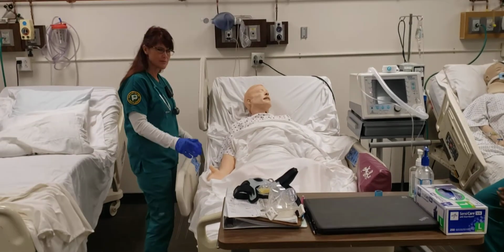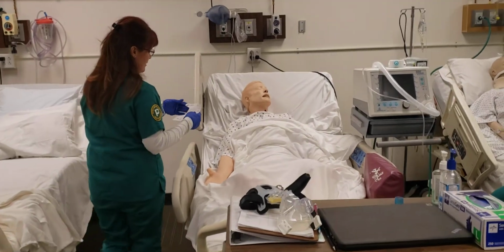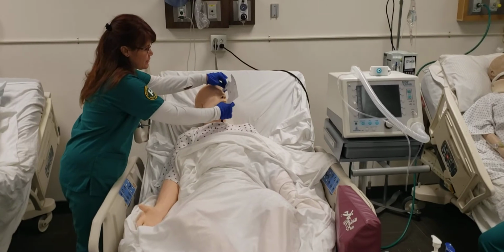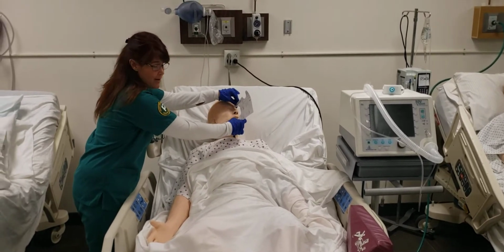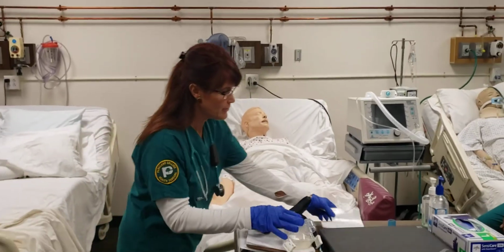The first thing I want to do is I'm going to go ahead and size your mask, so we have that ready. I'm going to put this on the bridge of their nose, and then just below their mouth, and have them open their mouth. So it looks like he's a medium. So at this point, we'll get our equipment ready.